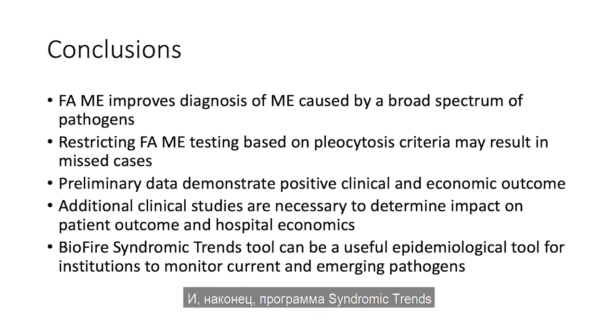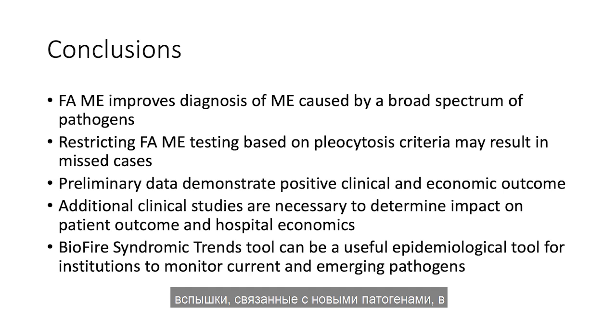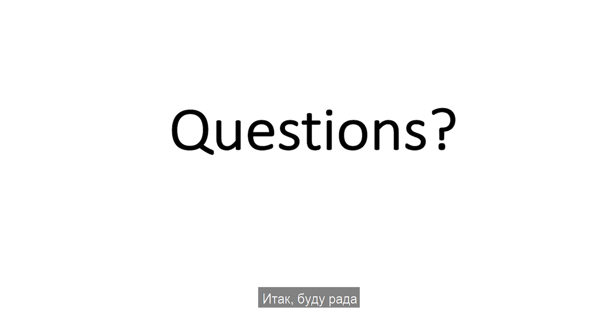And lastly, the Syndromic Trends tool can be a useful epidemiological tool for institutions that can monitor your current institutional data as well as emerging pathogens within the institution as well as the region. And with that, I'll be happy to answer any questions.